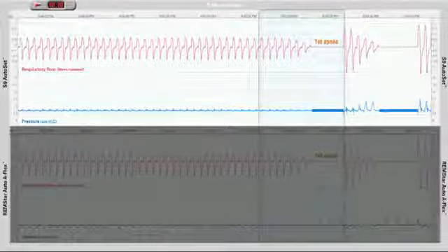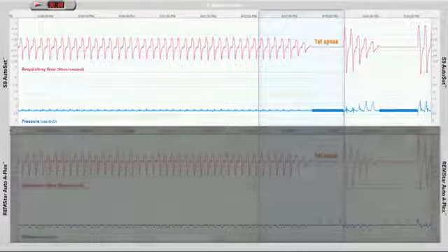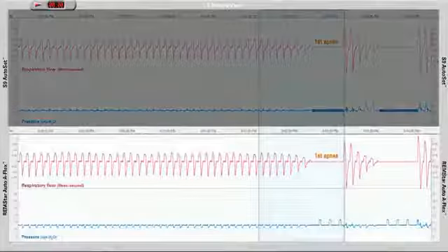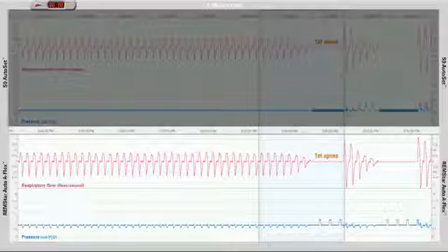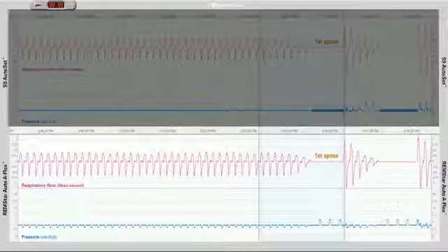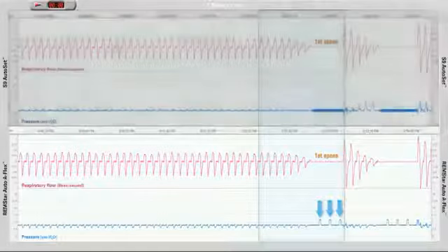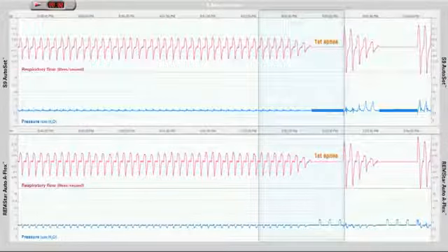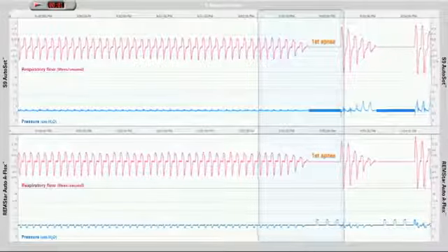In this instance, the S9 AutoSet detects that the apnea is obstructive. To detect if an event is obstructive or central in nature, the REMstar Auto device sends a 2 centimeter square wave pressure pulse that lasts for 2 seconds at intervals during the apnea to investigate the upper airway. Both patients take several deep breaths to end the apnea, which is typical of an arousal.